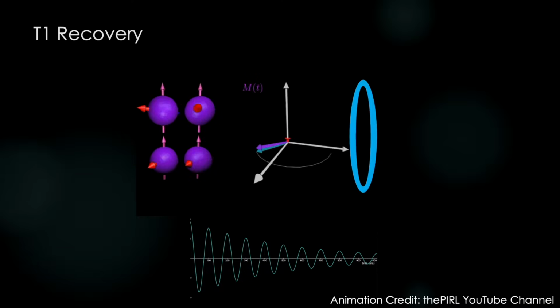Here we see our net magnetization, the arrow in purple, spinning after being excited, and alongside it we are being shown its subcomponents in both the xy plane and z-axes. Notice how the purple arrow spirals upward, building its full size right as it perfectly realigns back with the z-axis. And it's tracing out a spiral in the xy plane, representing our T2 decay, shown below. Does anything strike you as odd or puzzling here?